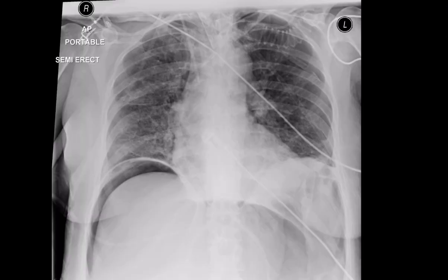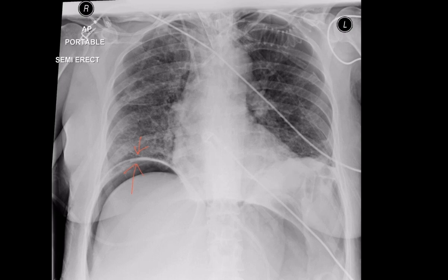In this erect chest X-ray, you can see the football sign here. Both sides of the diaphragm are seen here. This is also due to pneumoperitoneum.